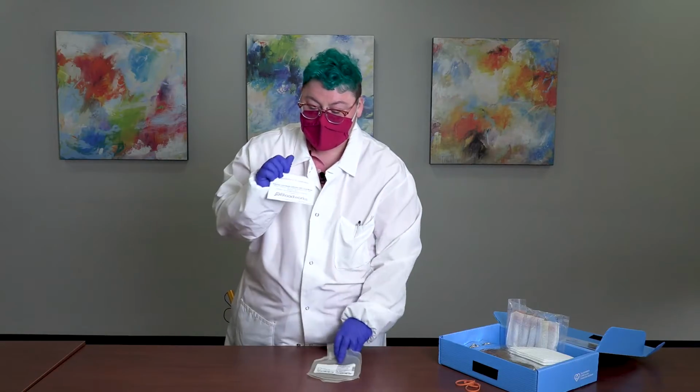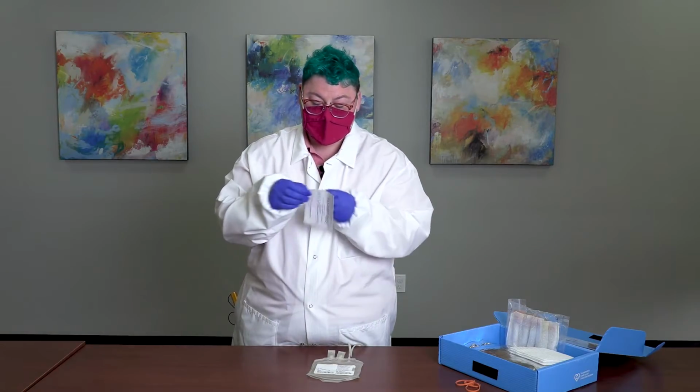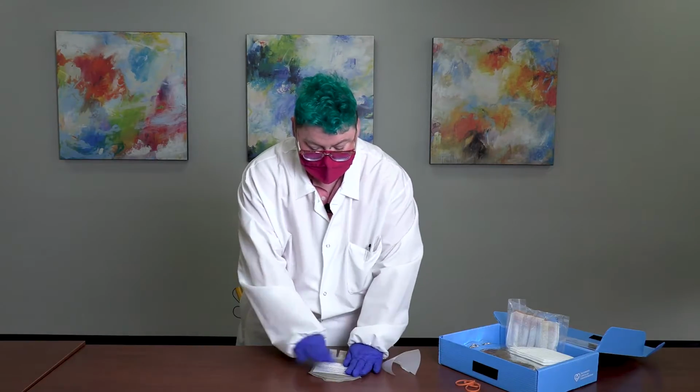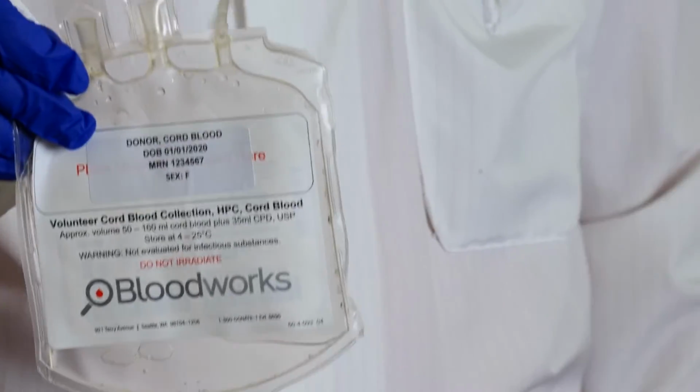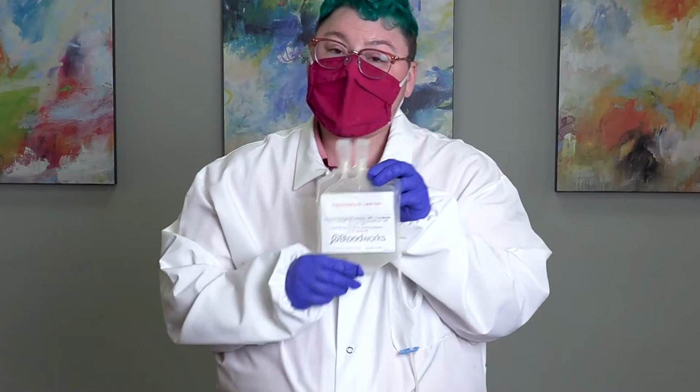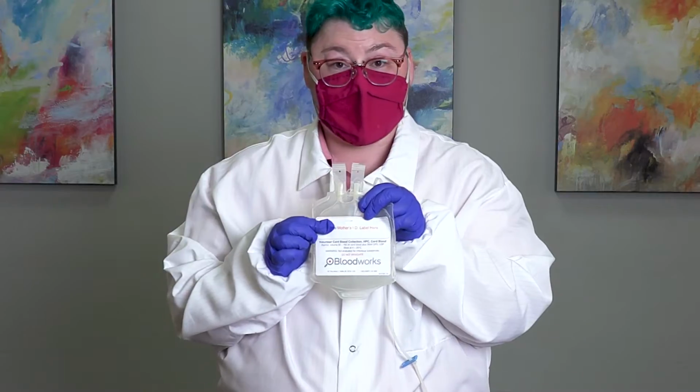So the base label will be attached. And then the hospital label from the patient will go directly on here. If we receive a cord blood unit without this base label, we're not able to use it. So please don't forget to include this label.